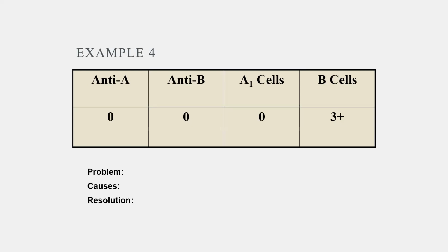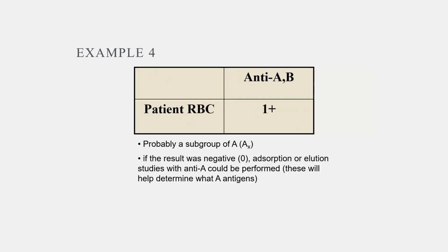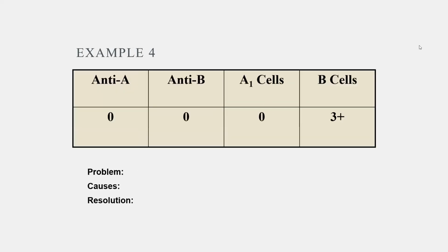So anyway, what we would do with this one, because we want to see if it's a subgroup, is test with anti-A,B. And usually, if it's an A or B subgroup, the anti-A,B is a little bit stronger and it would show a reaction. So we have a reaction. It's most likely a weak A. And we think it's an A because they do have anti-B. So we don't think it's a B subgroup. We think it's an A subgroup.